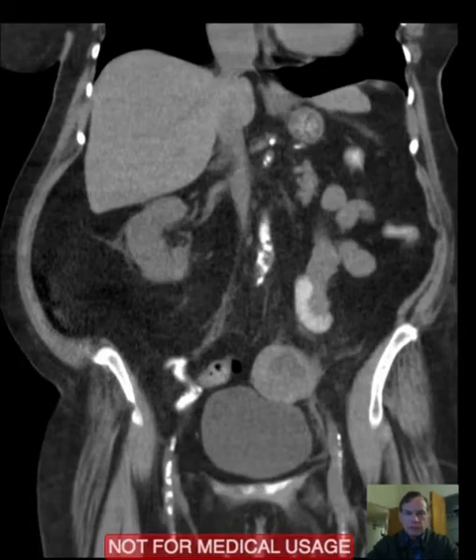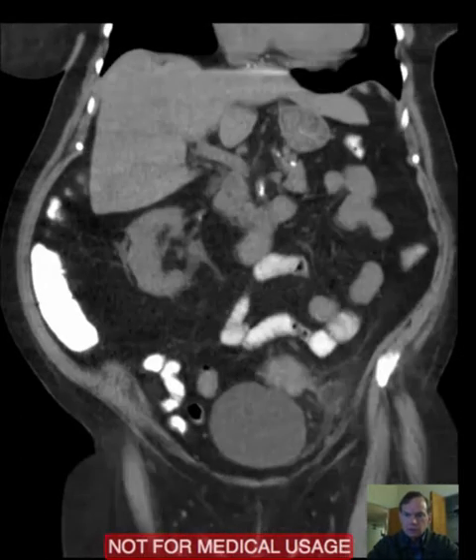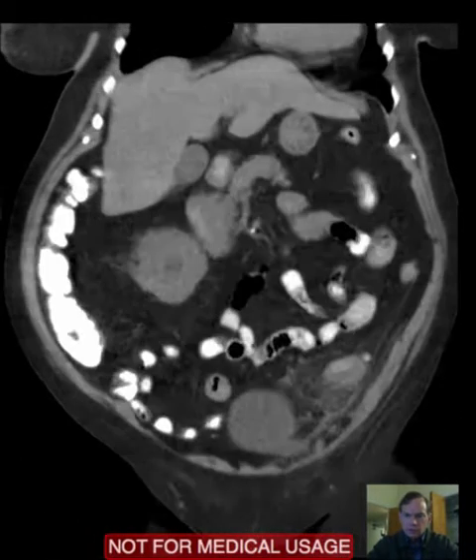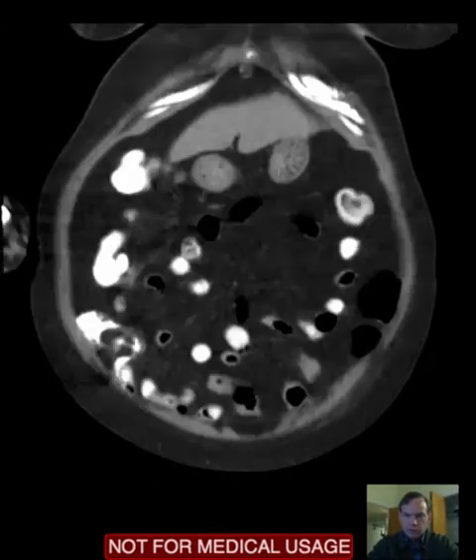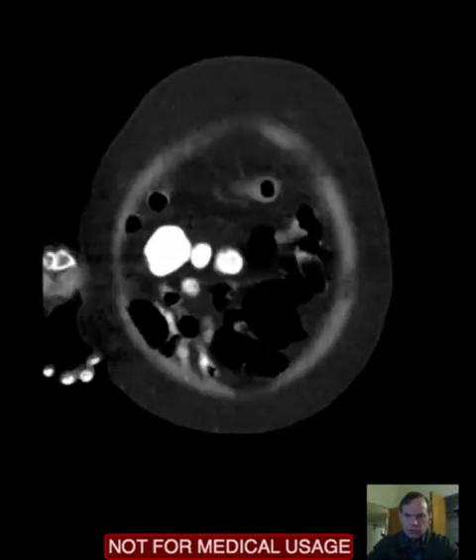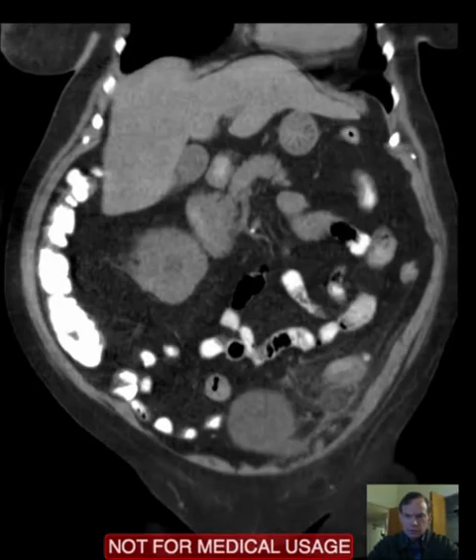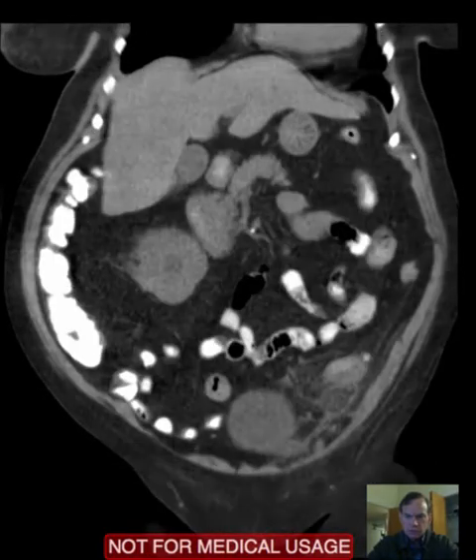Hello there, this is Dr. Mintz. This is a CT of the abdomen on a patient with left lower quadrant pain. It's been going on for several hours. Here are the coronal images, and I call your attention to the left lower quadrant.